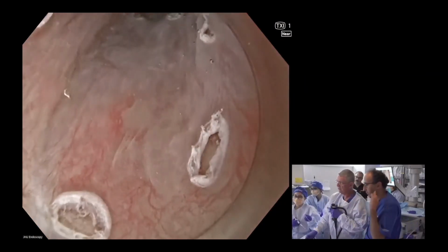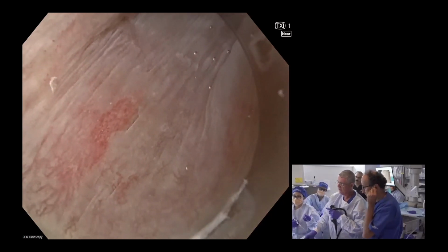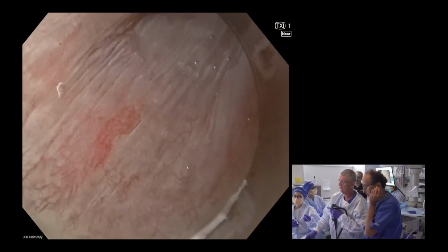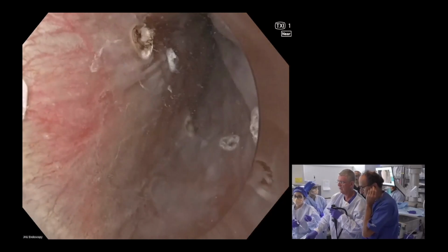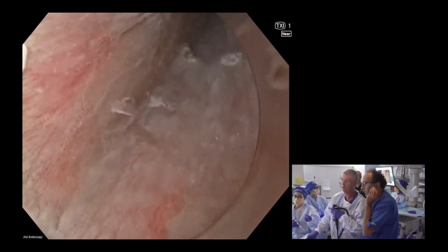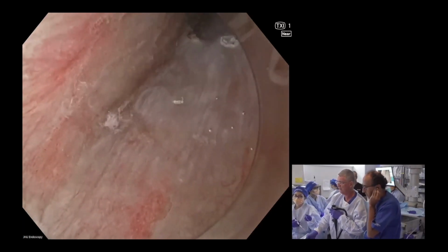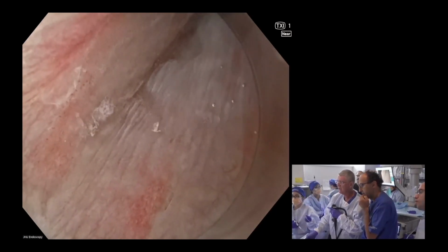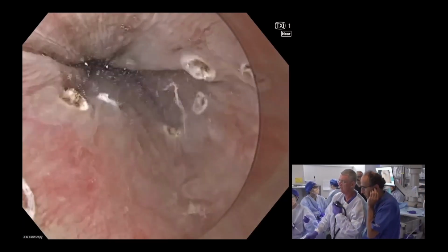A very, very minute multifocal dysplasia. Histopathology showed high-grade dysplasia, and you see these small areas looking more reddish in TXI. You see here also. These lesions were also biopsied, so you have to be careful because sometimes when you biopsy those lesions, the lesion may disappear for a couple of weeks, especially if you perform Lugol plus biopsy. But you see there are changes in the vasculature, and also they look slightly more reddish with TXI.